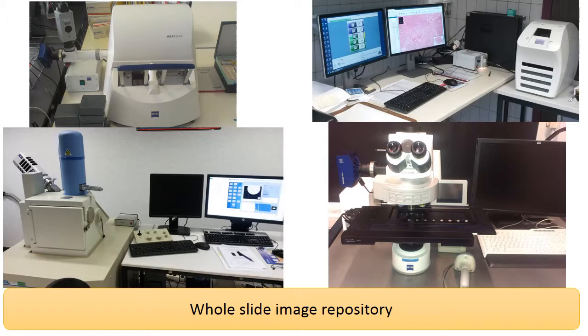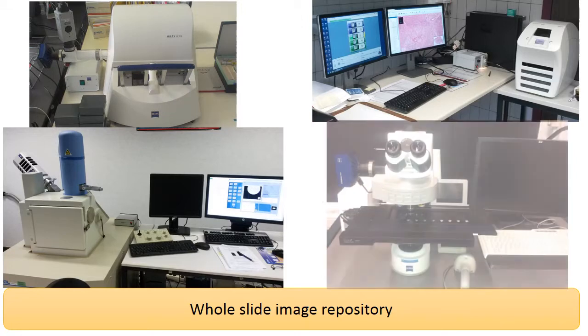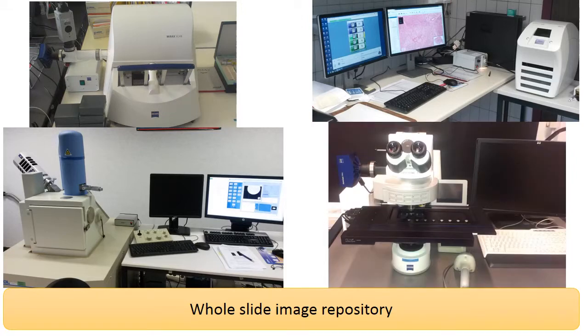As more interesting samples become available, you could also replace previous material. It doesn't matter what vendor hardware you use to scan your slides with. You can use a slide scanner, a robotic microscope, bright field or fluorescent observations. And in the near future, we plan to even support electron microscopy file formats. If you're uncertain whether we support your file format, contact us and see what we can do for you.